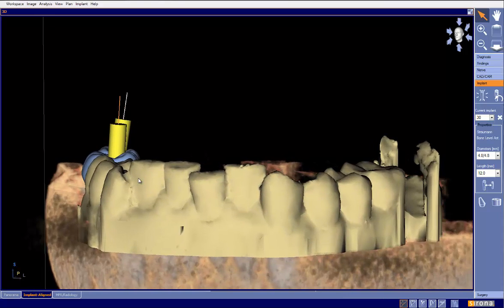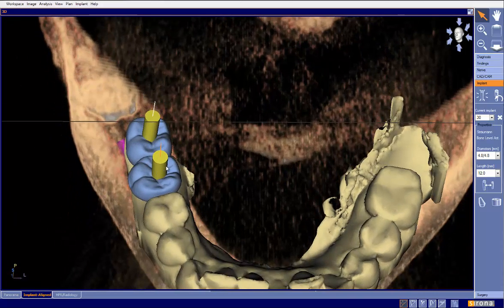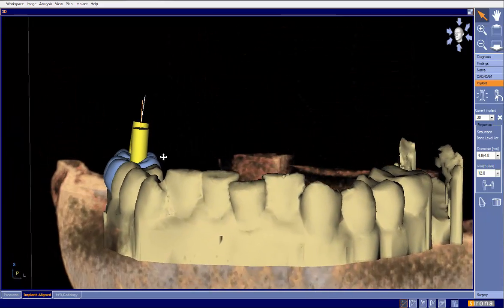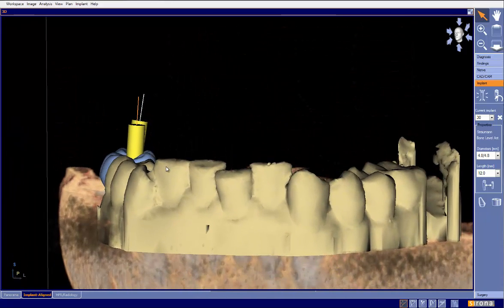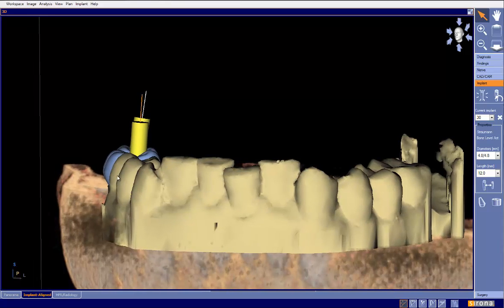The other thing I'll point out here is in our CEREC design, if you look at this, it looks like I'm more to the lingual here. And I did that on purpose. Because if we look at our CEREC design, and this is why I'm such a stickler about our CEREC designs being perfect, if we were to look down this path, we can see that the buccal of this tooth is actually too wide.